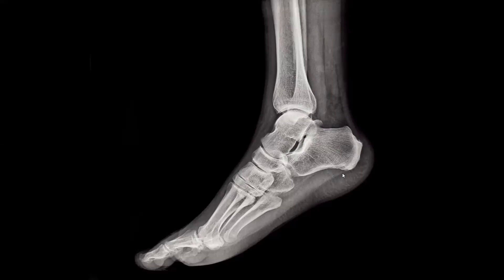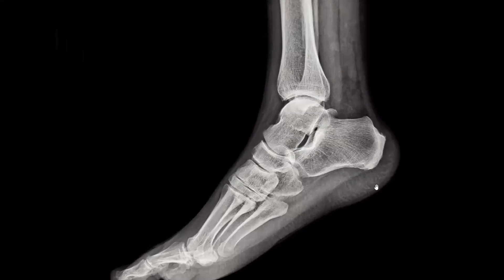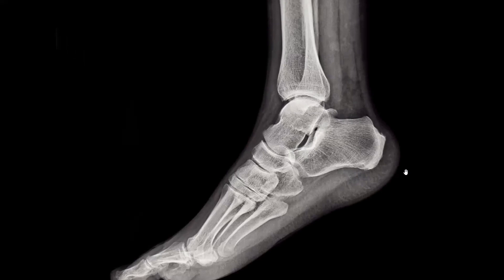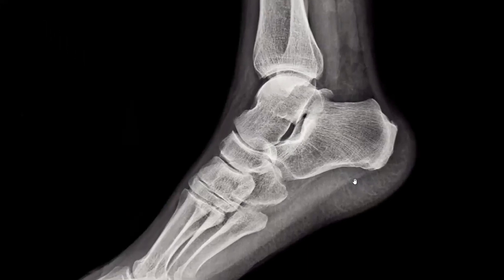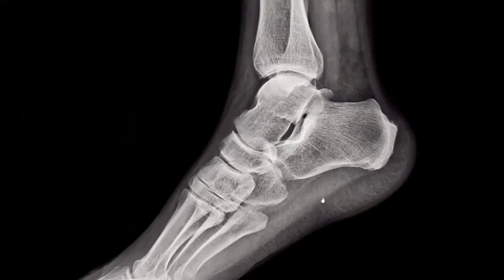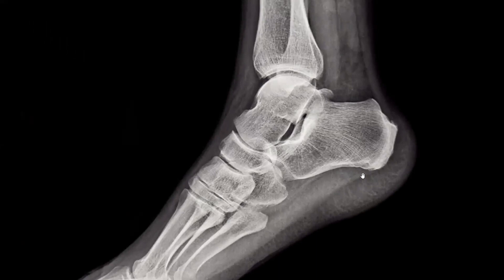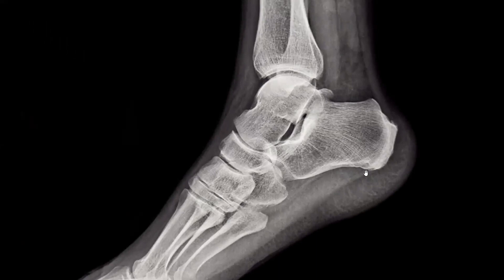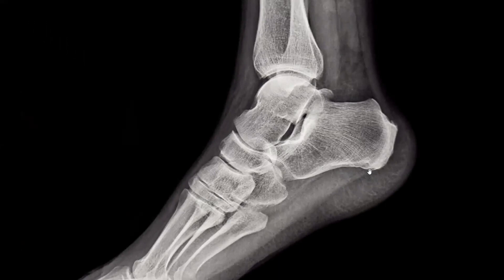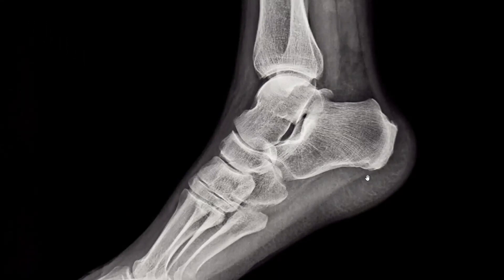If I zoom in on this, you can see the plantar fascia posteriorly. It's usually a few millimeters thick, and it's just at the inferior most aspect of the calcaneus.